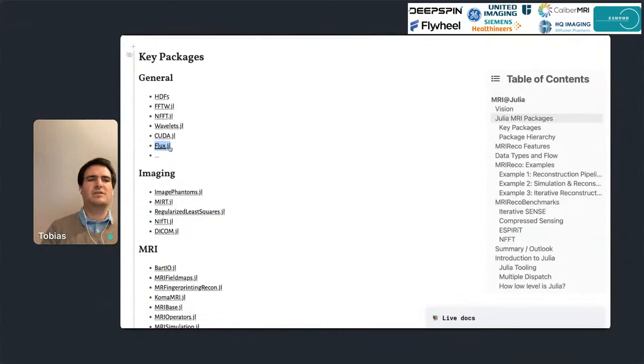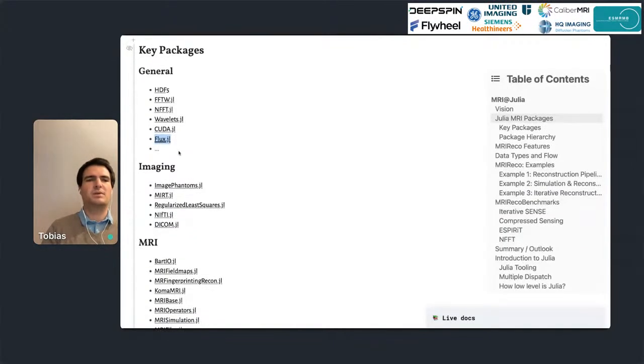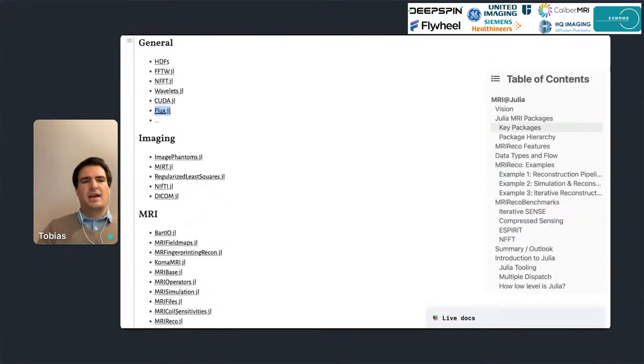I use that actually to replicate PyTorch examples, and I think this is on the same level of maturity, at least for doing such deep learning based MRI reconstruction stuff like we do in MRI research developments.